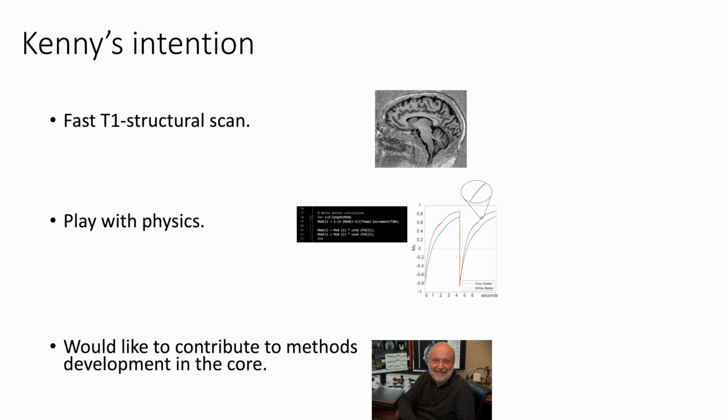as an MRI tech. As a tech, a lot of time we see people running out of time because the high resolution MP2RAGE takes about 10 minutes. And when people are running out of time, they either shorten their tests or don't do the MP2RAGE at all at the end. Or some people may reduce the time on the MP2RAGE, but it's very difficult because if you reduce the number of slices, the TI time changes, and also the sequence itself is FLASH based.